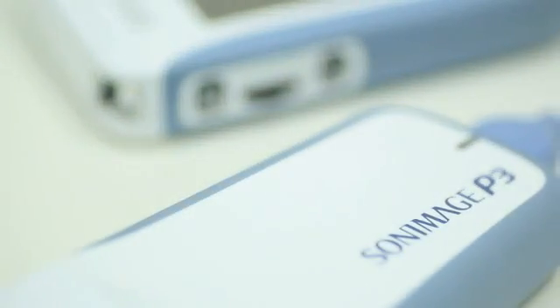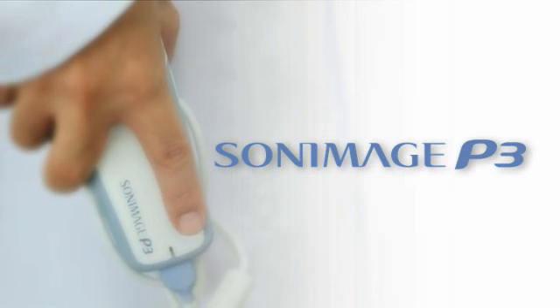Easy to use and with a wide range of applications, the SONIMAGE P3 is creating a new future in ultrasound diagnosis.